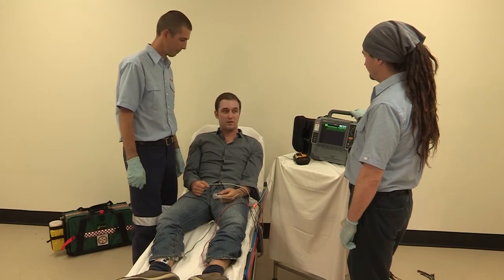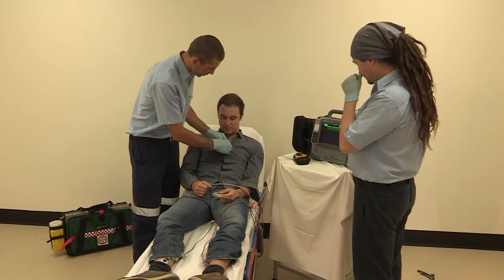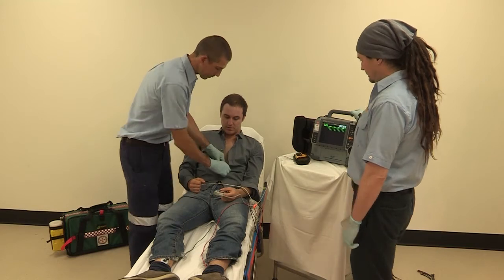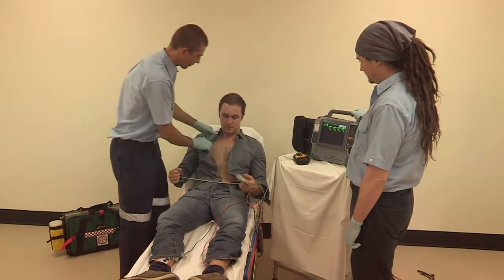Ask the patient to lie down flat preferably, or if this is too uncomfortable, you can sit them in a 45-degree angle. You'll need to expose the patient's chest. When doing this, you can maintain dignity by using a sheet to cover the upper portion of the body.